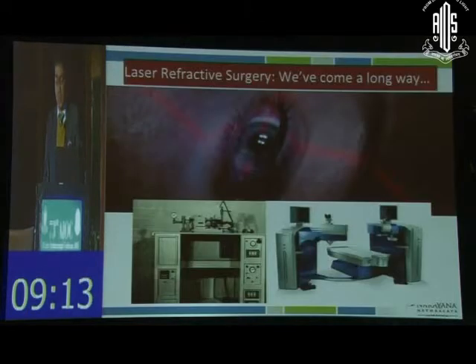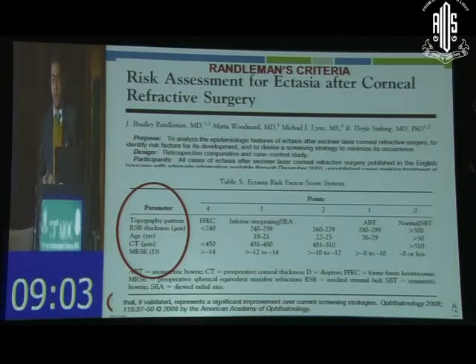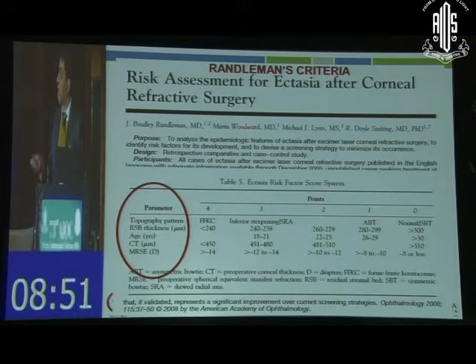That's when LASIK started coming into the picture. For example, this is how it started, and this is the kind of change. What you're seeing is phenomenal. I don't need to go into this, but I'll spend a minute on it, because for anybody starting with refractive surgery, I'm not saying it's the perfect guideline for any refractive procedure, but it is still one of the most useful manuals to prevent a complication.